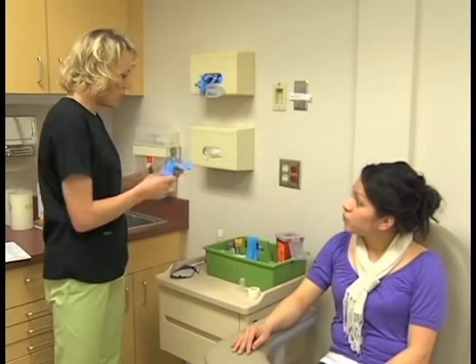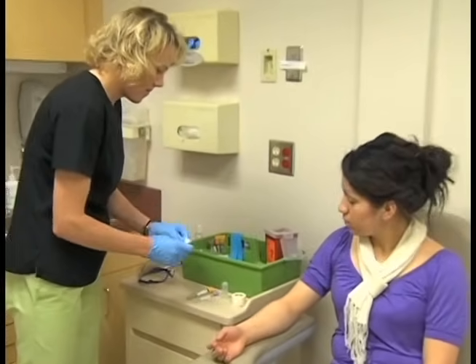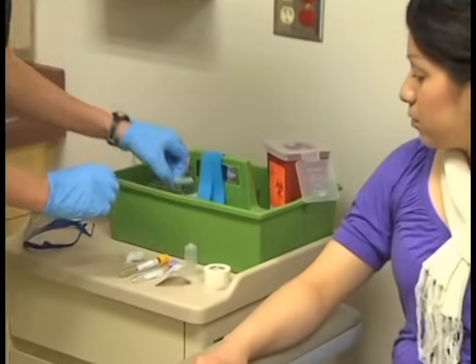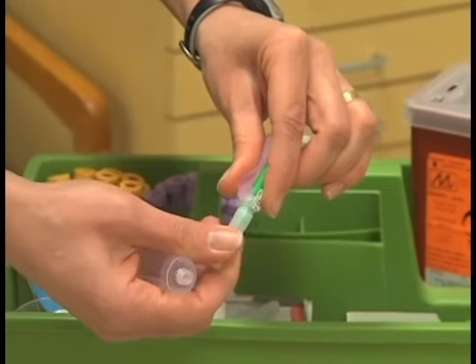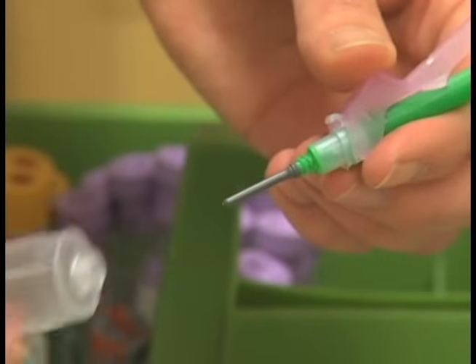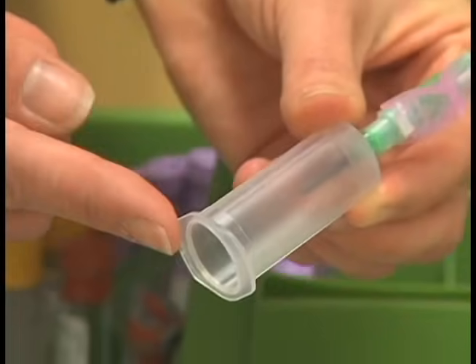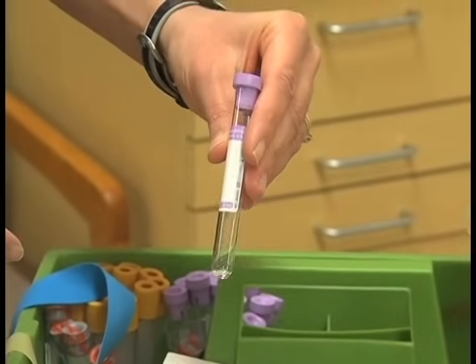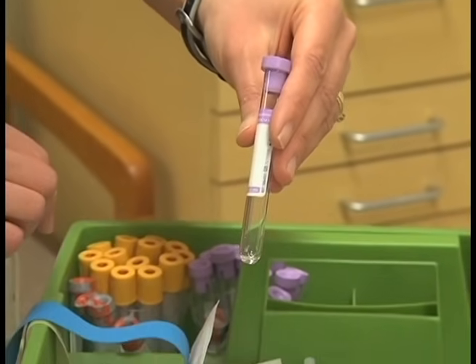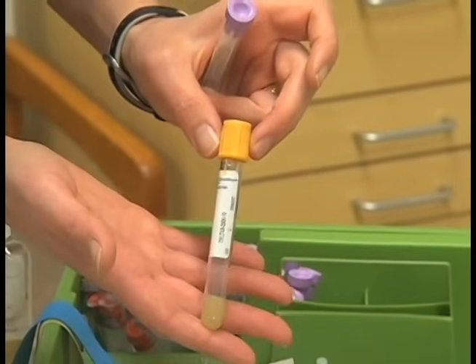Sanitize your hands. Assemble the equipment and select the proper tubes for the test to be performed. Prepare the vacuum tube system by removing the cap from the posterior needle using a twisting and pulling motion, then insert the posterior needle into the small opening of the plastic holder and screw the holder onto the Luer adapter, tightening it securely. In this demonstration, we will be drawing a lavender purple top tube, the most common tube used for a complete blood count, as well as a gold serum separator tube.